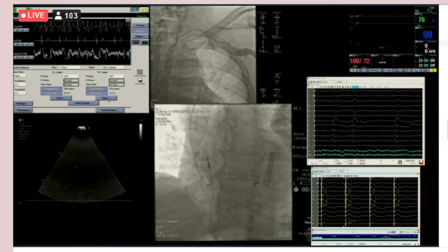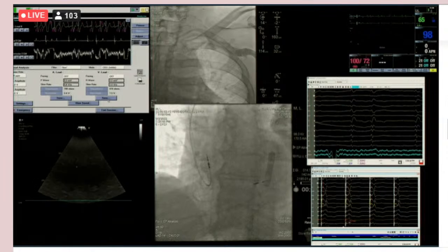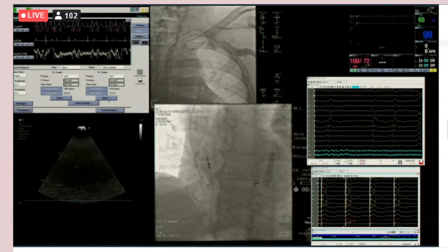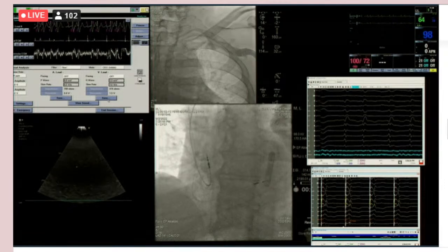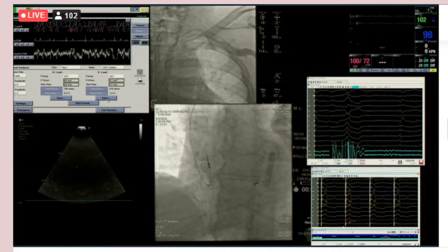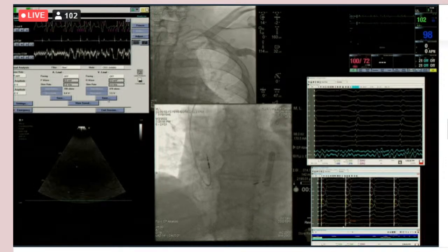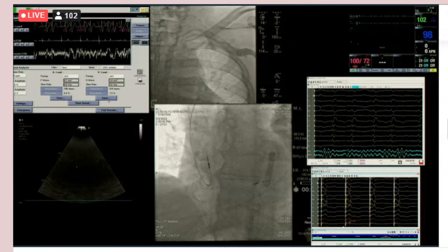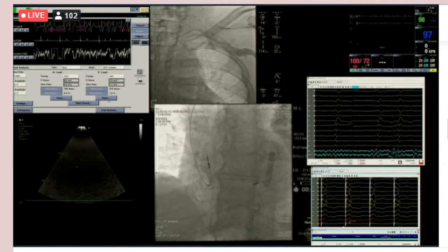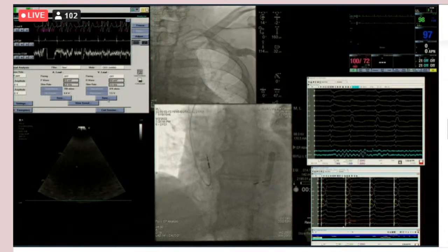The comment, though, on why I asked Rodney: when it went from 2 to suddenly wide, that's when it likely went selective. Yeah. And with left bundle branch capture, it should be wide. It's the opposite of His bundle pacing, where non-selectivity is wider with His. Non-selectivity is more narrow in left bundle. So he went from non-selective to selective, which is why I asked why he didn't like it. I think he wanted non-selectivity at 2, but when programmed outputs, it's going to be higher than 2 acutely, and usually these come down with time, and there's injury, et cetera. And then obviously with bipolar, you get anodal capture, although anodal capture seemed like it was a little bit worse here.